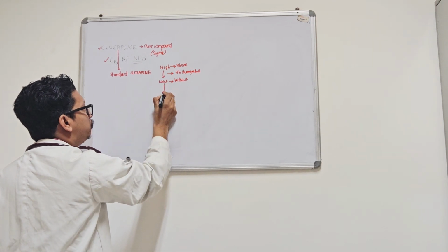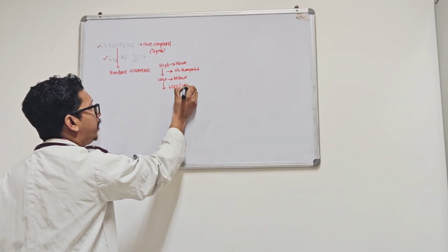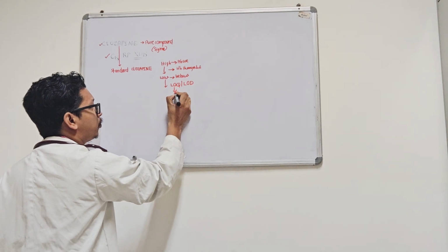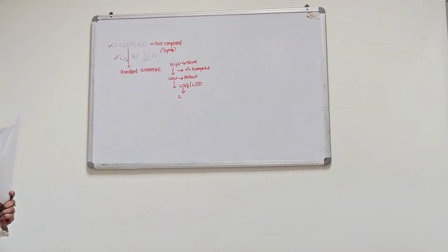The one below the therapeutic level is for LOQ and LOD determination. LOQ is limit of quantification and LOD is limit of detection.